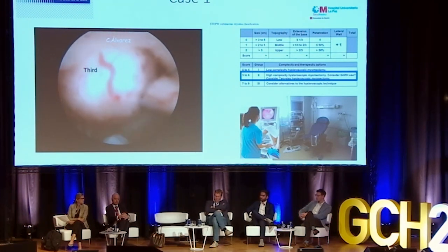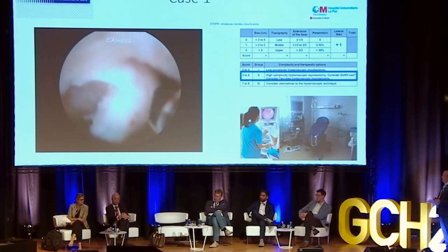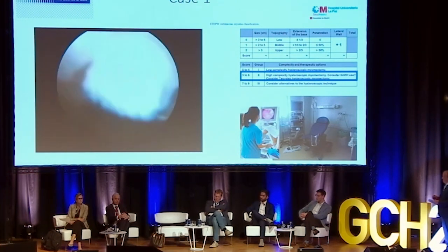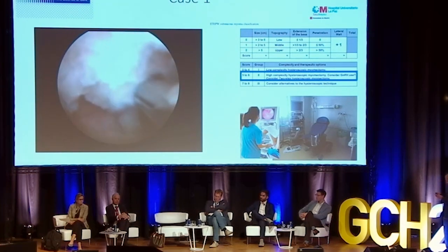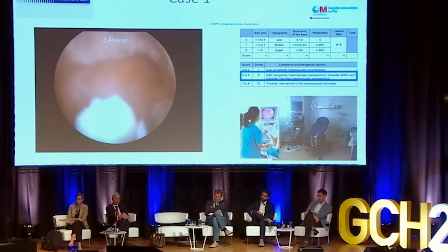It is a myoma of 3 centimeters, type 2, and in this case, the consistency of the myoma is a little bit harder, so the tissue removal of the device is going to be a little bit lower, and the surgery is going to be a little bit longer. In this myoma, we need to change our movement depending on the discomfort of the patient. You need to remember that we are in an office without anesthesia, with an IV line.